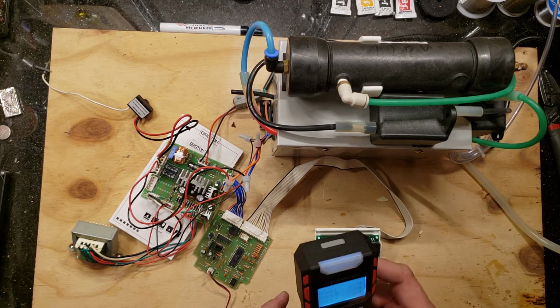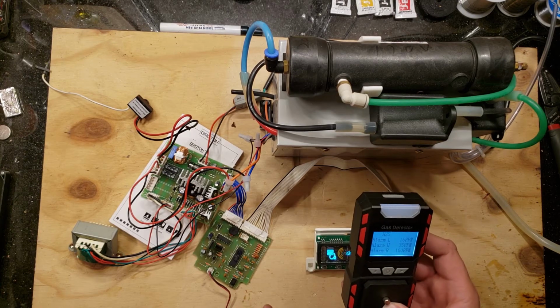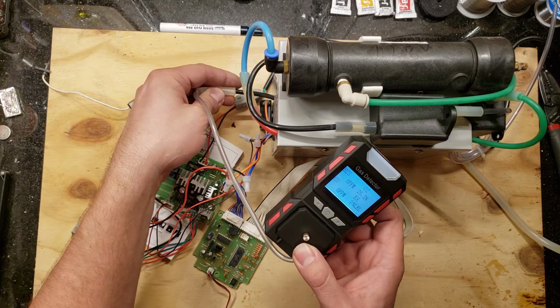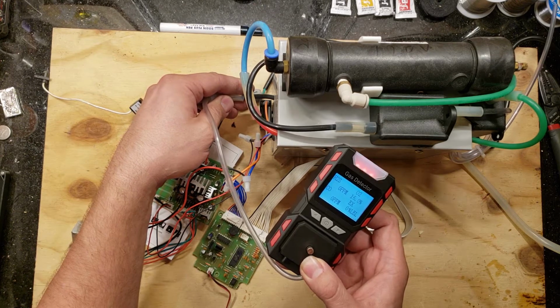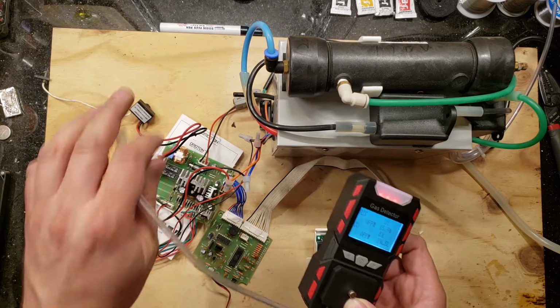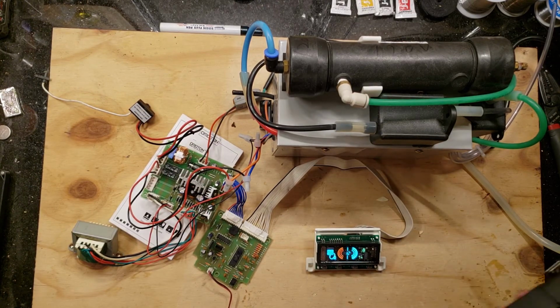So let's see what we got. Come on, boot up. Still showing 26%, but now... Attention please. Oxygen gas low concentration. Welcome to use intelligent voice gas detector. So yeah, this thing is definitely working.